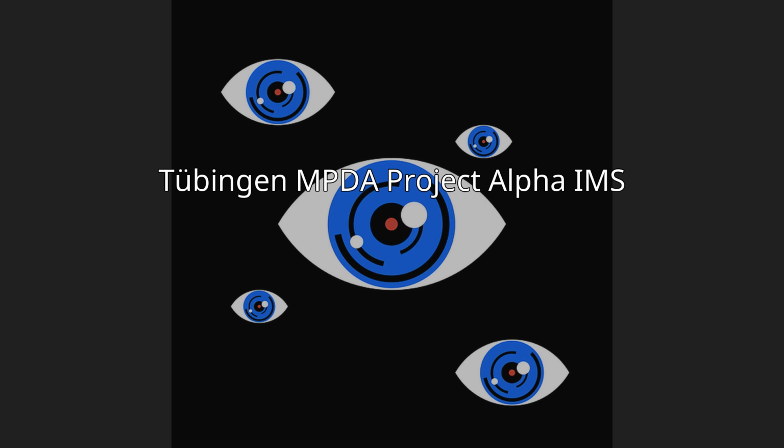The German team commenced in vivo experiments in 2000, when evoked cortical potentials were measured from Yucatan micropigs and rabbits. At 14 months post-implantation, the implant and retina surrounding it were examined. The implants were successful in producing evoked cortical potentials in half of the animals tested. The thresholds identified in this study were similar to those required in epiretinal stimulation.